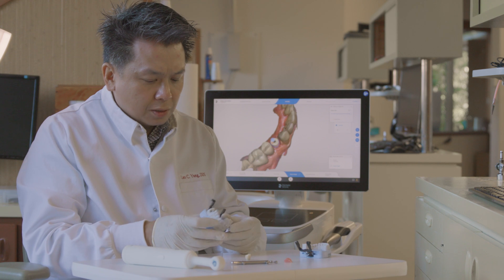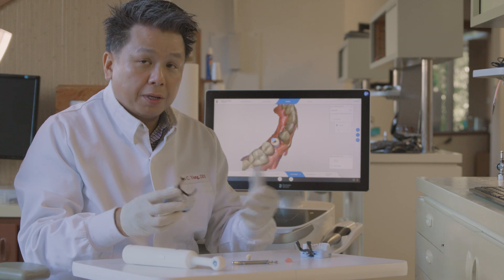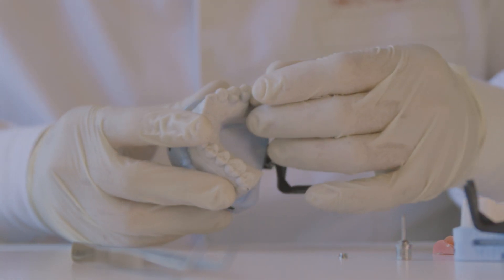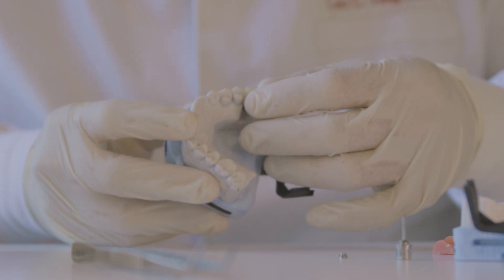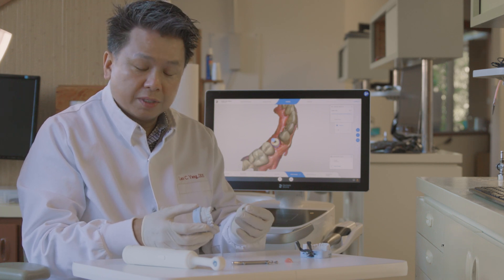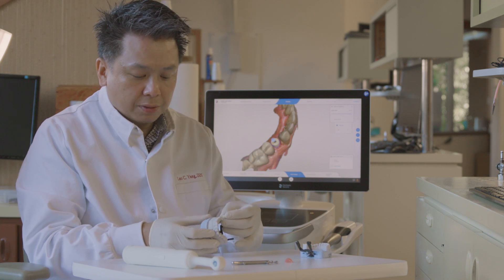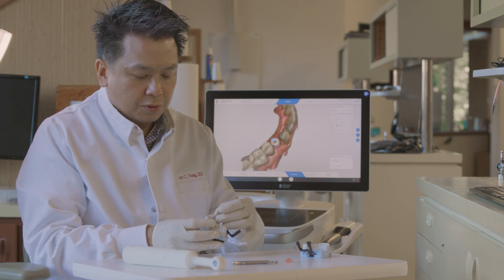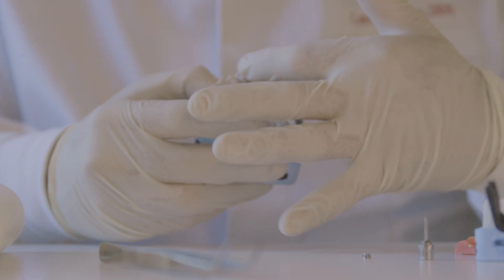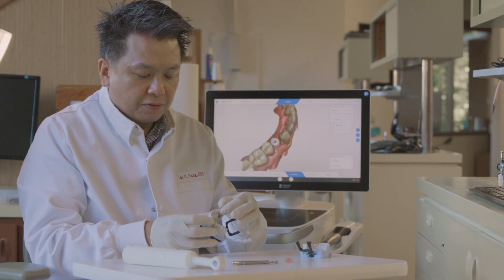Step one. It is important to check everything on a model first, outside of the mouth, just to make sure everything is aligned perfectly. We have this beautiful implant crown — a Roto crown made from Arm Dental Lab. You want to make sure that it's seating onto the Roto abutment correctly. You also want to make sure that the occlusal contact is good and your interproximal contact is good.